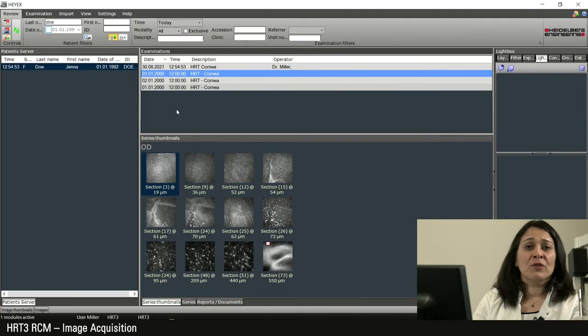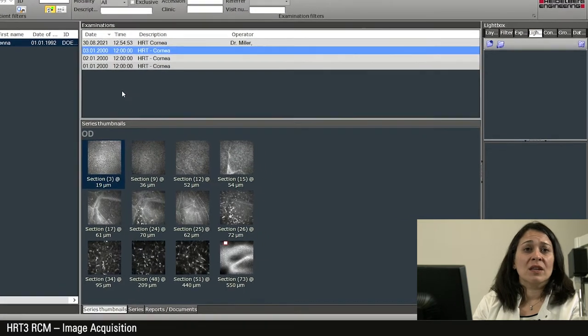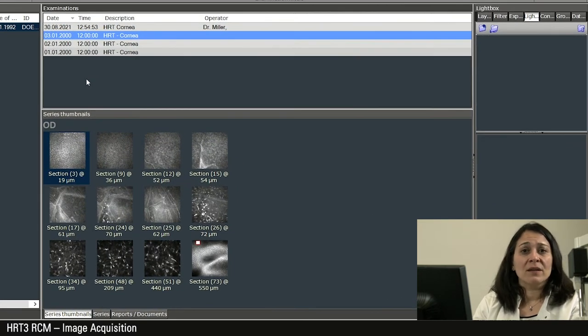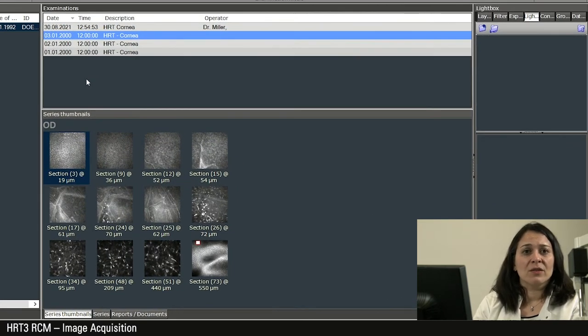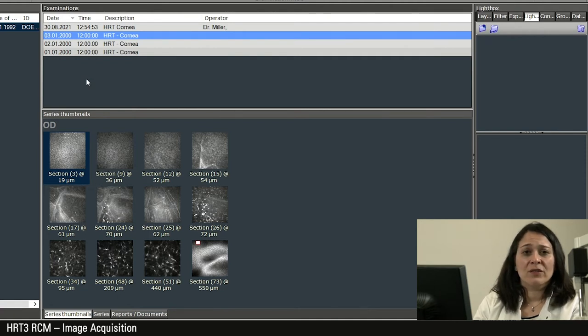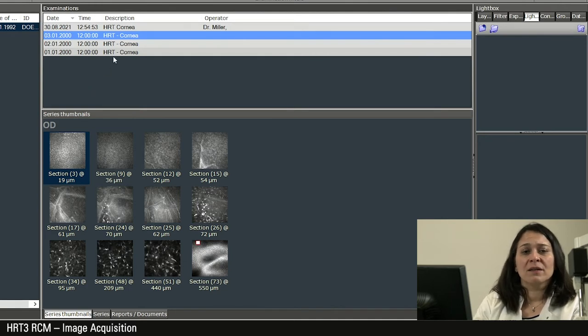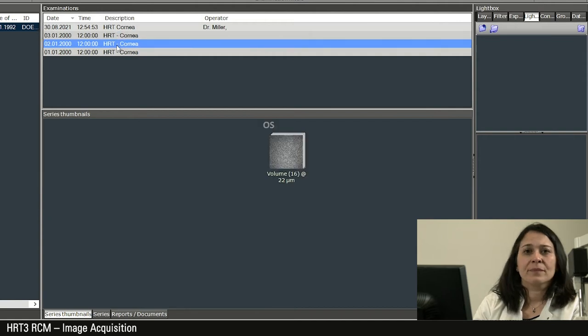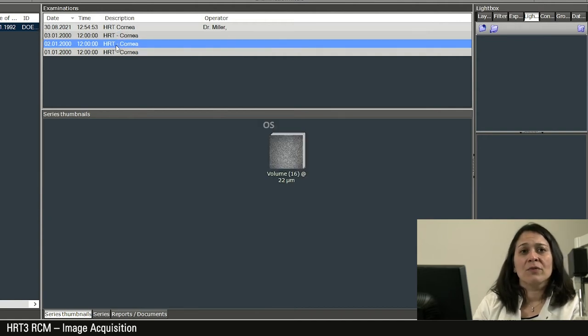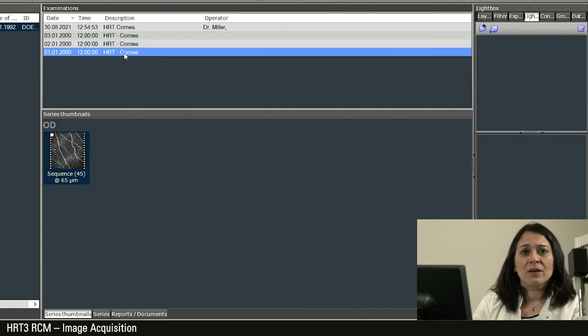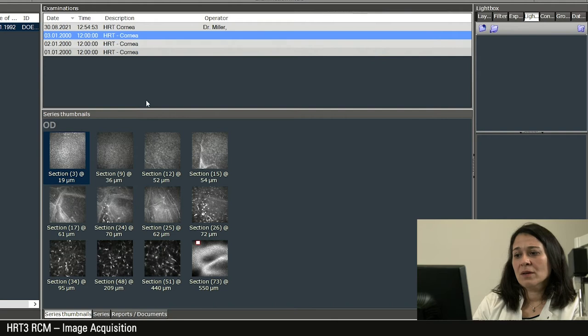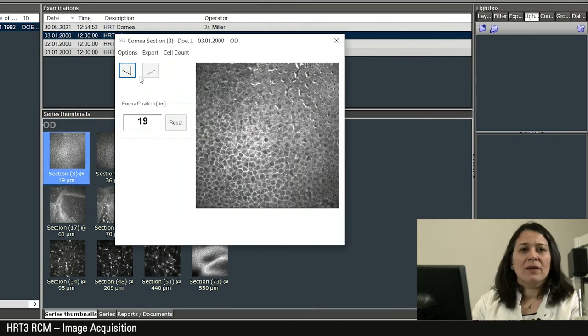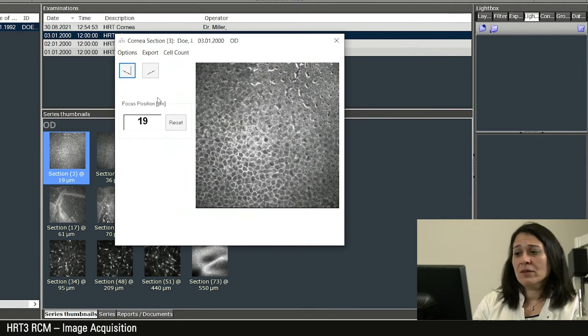In the image viewing interface, you can now see the acquisitions that have been made. Here you can directly recognize the tissue depth and the acquisition mode of the preview images, that is section, volume, and sequence. You can recognize a volume scan by the fact that the preview image looks like a book. A sequence scan is displayed with film strips. Double click and open an image. There you can see the focus position and navigate to other scans.